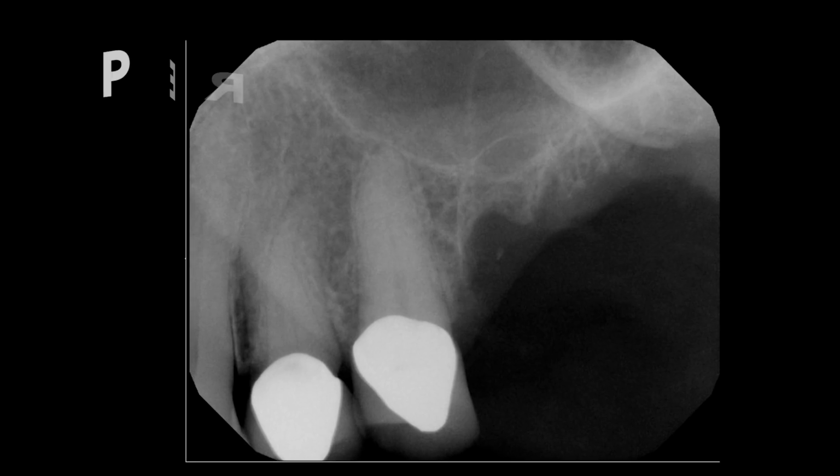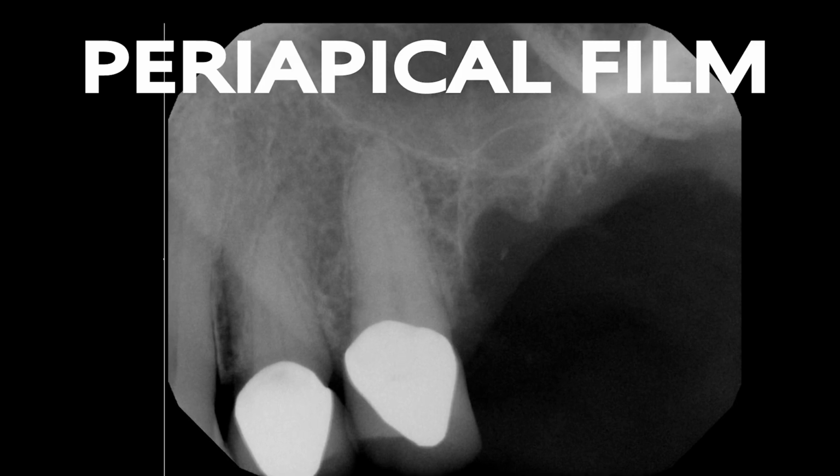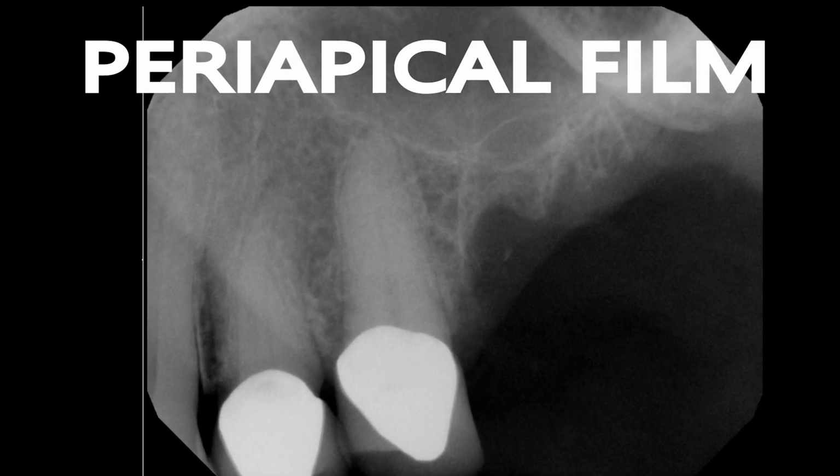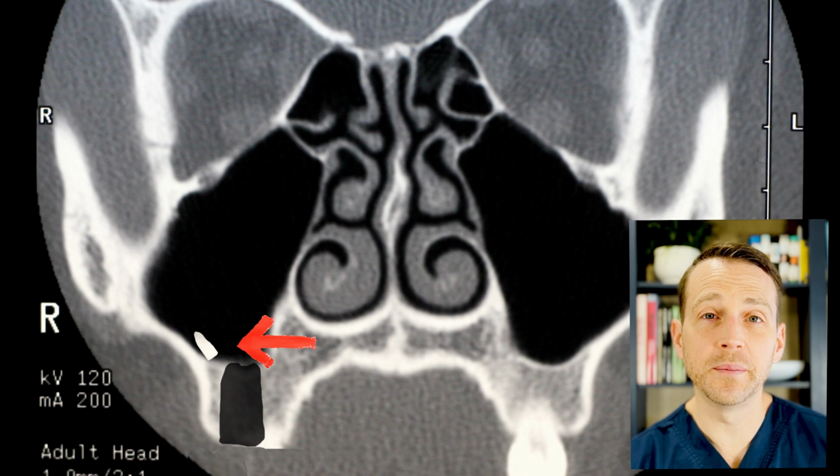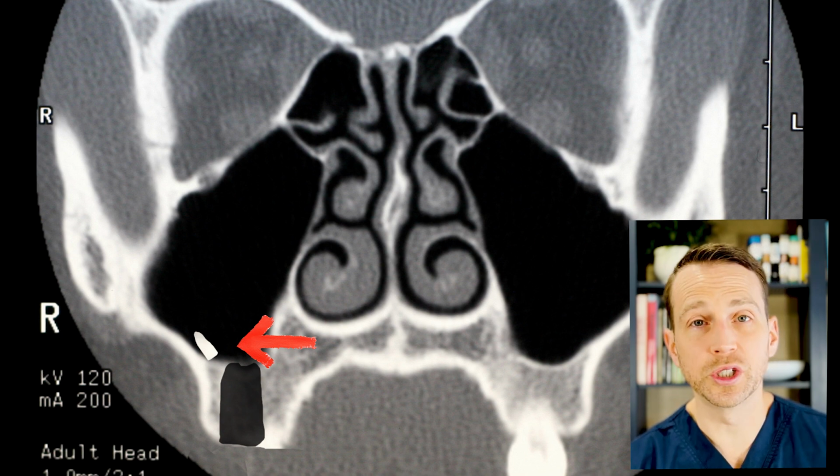A periapical film can be helpful to confirm whether or not the root is still in the extraction socket, but if the root did fall into the sinus, a PA most likely is not going to spot it. The cone beam CT confirmed that the root was in the maxillary sinus, so the next step was retrieving it.